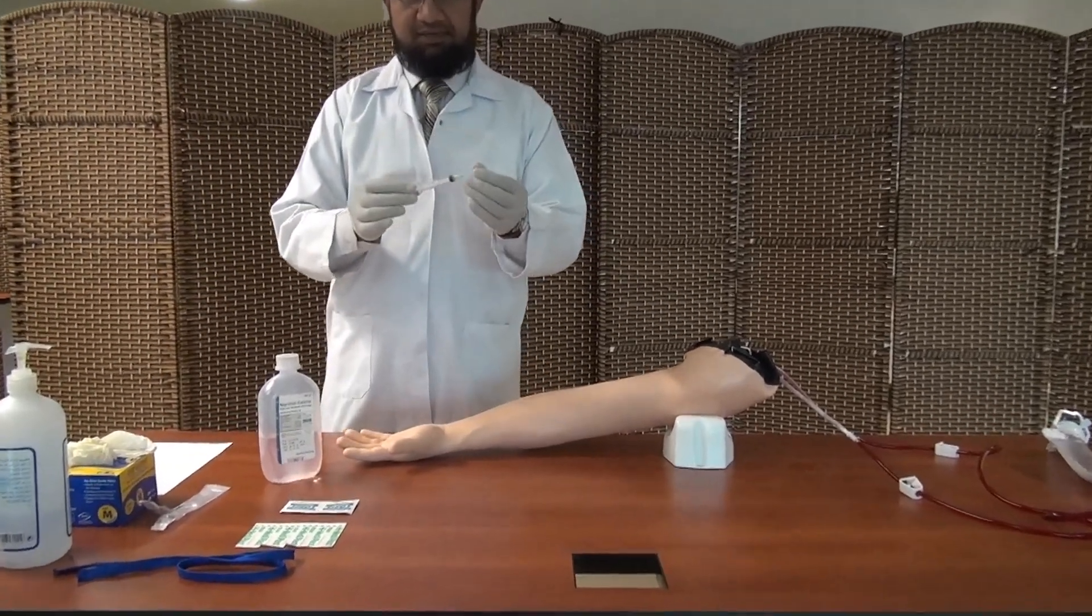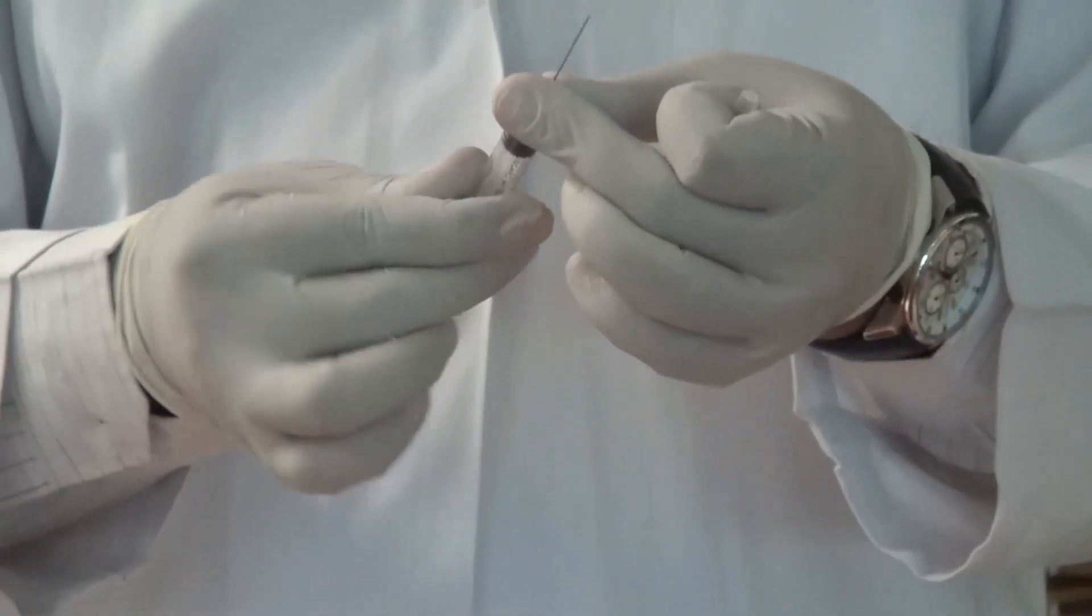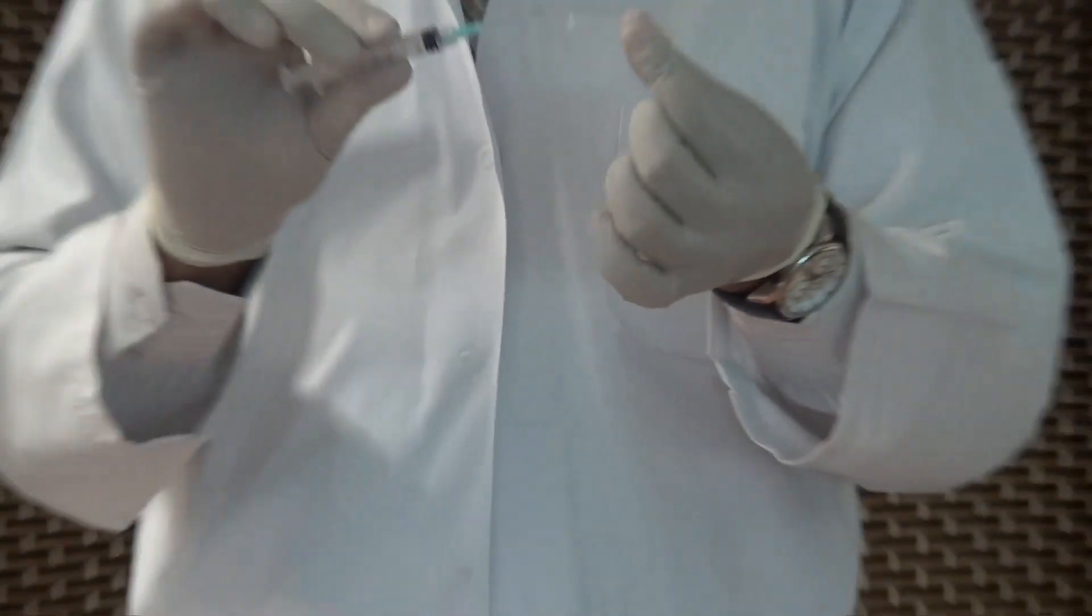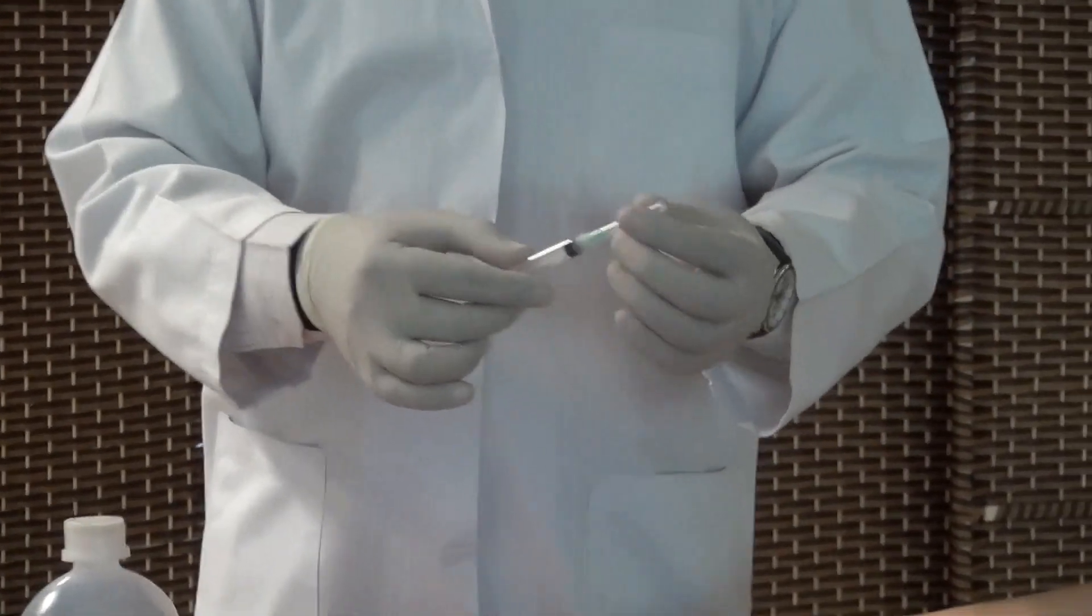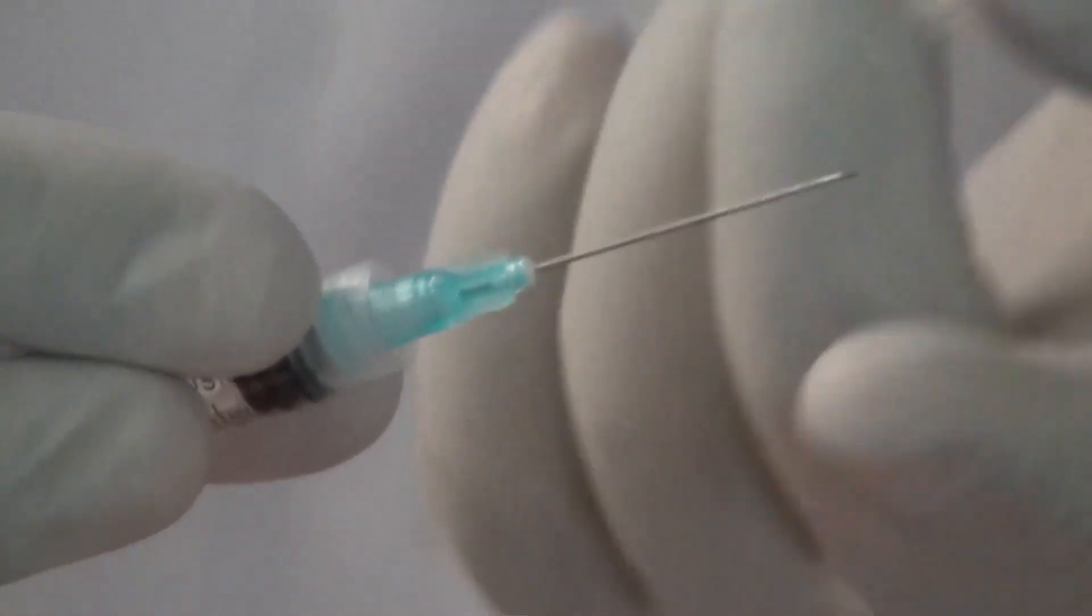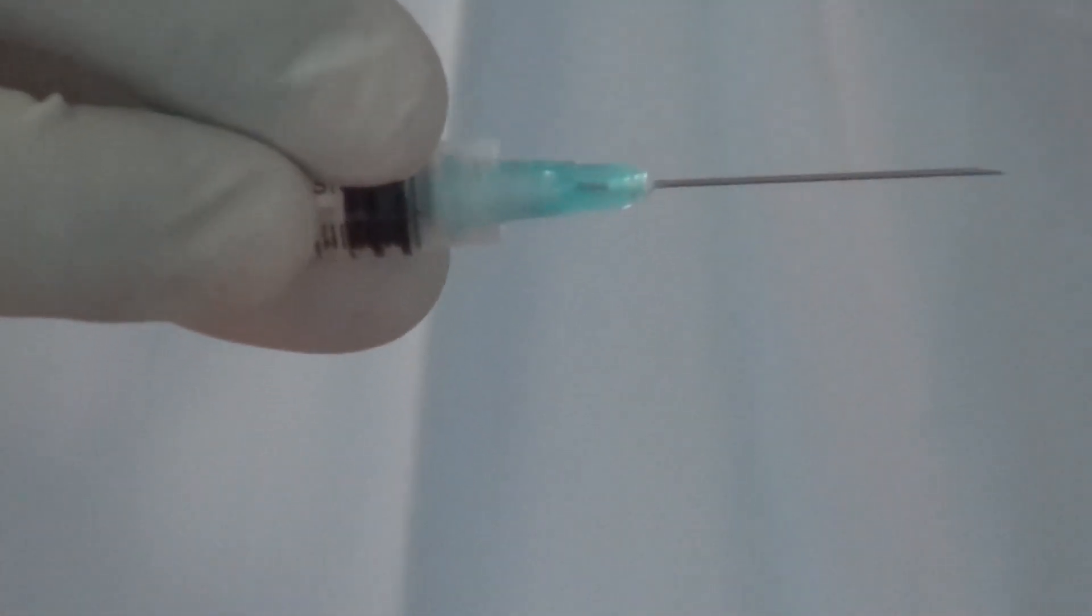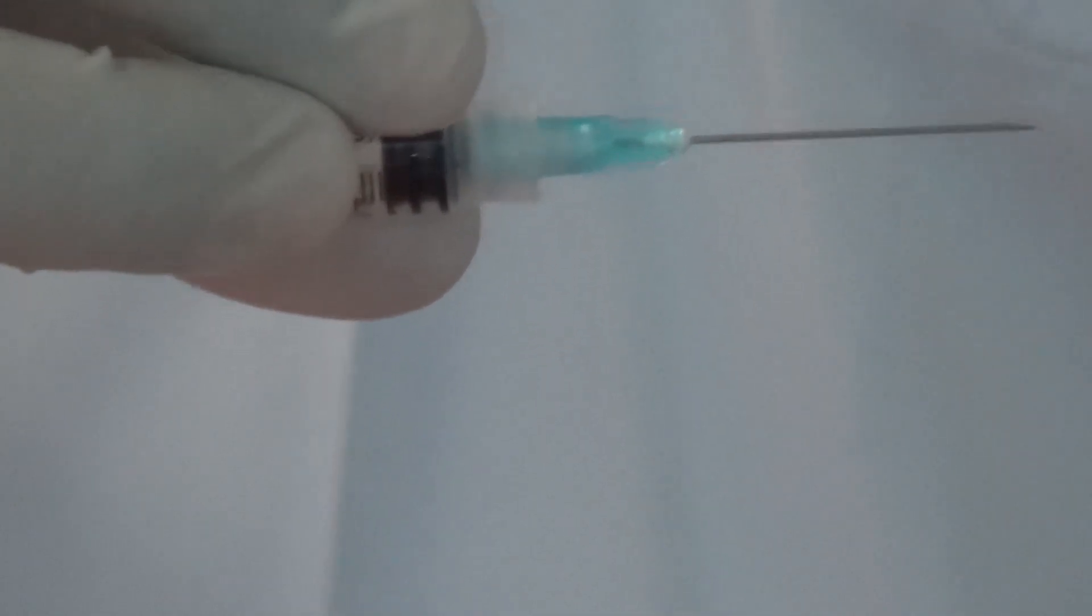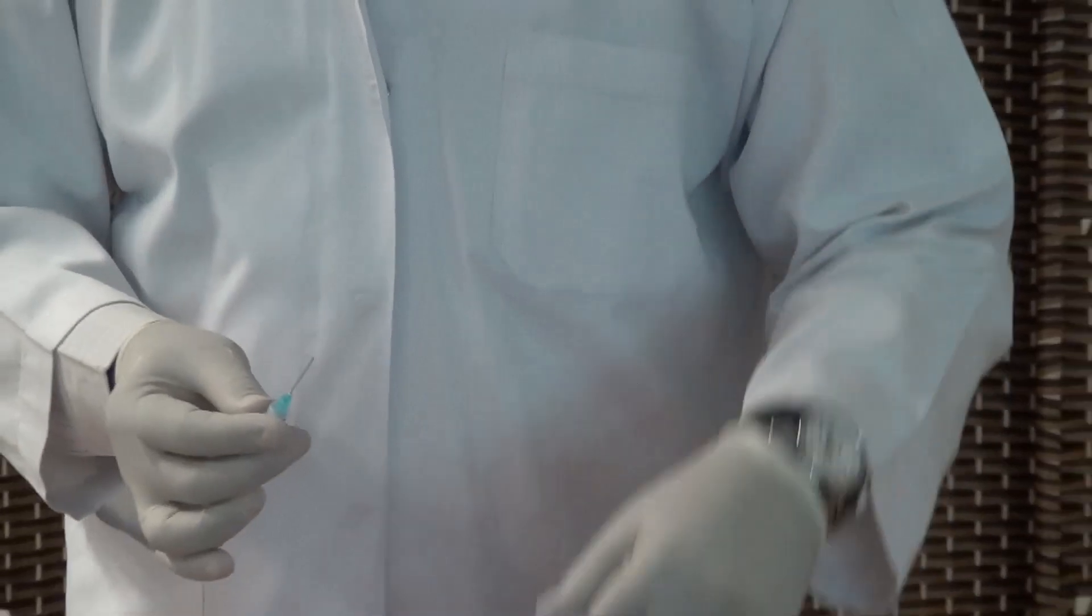So now, this is a typical disposable syringe which has got the chamber which will be filled and a needle which is attached at the front of it. There is a cap of the needle which covers the needle part so that it doesn't poke yourself unnecessarily. The needle, if you could zoom in, has got a bevel up and a bevel down. The way I am holding it at the moment, the bevel of the needle, the cut part which gives it the insertion point, is now positioned upward. This is the one which you will keep in mind when you get into the vein.